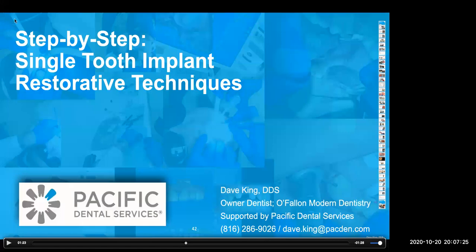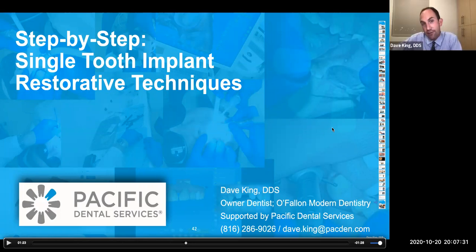Great. And is there any specific reason for using an Emax in posteriors instead of a zirconia? Yes. As a general rule, my preference is to use Emax over zirconia unless Emax fails more than once. And the rationale for that is mostly two things. Number one, bondability. Number two, aesthetics.